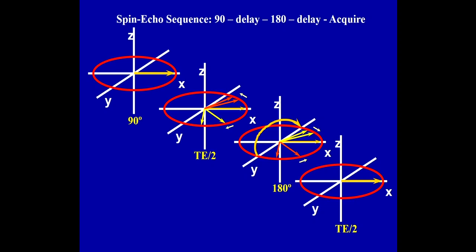And what I've drawn here in red, this isn't T2, this is T2 star. So we're ignoring the T2 dephasing. We take our original vector, and now one side of the image pixel is rotating counterclockwise because it's got a little bit less B0 in it than the other side. So that's the red vectors. Here we have the yellow vectors. They have a slightly higher B0, and therefore a slightly higher Larmor frequency. So they're not exactly with us in the rotating frame, and they'll rotate clockwise.